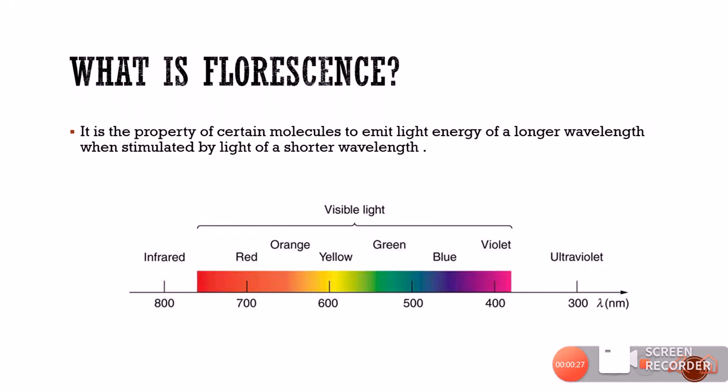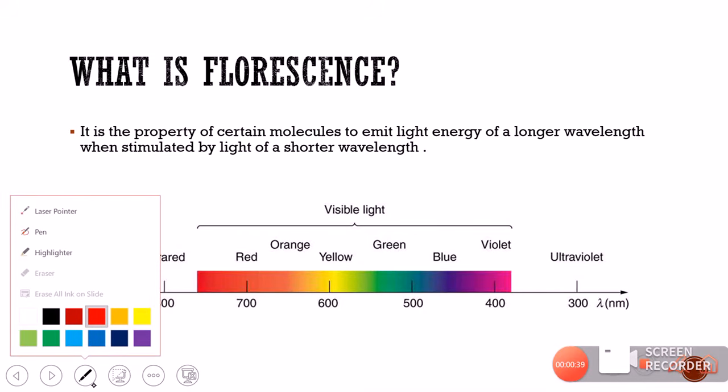Now, what is meant by fluorescence? Fluorescence is the property of a certain molecule to emit light energy of a longer wavelength when it is stimulated by light of shorter wavelength.